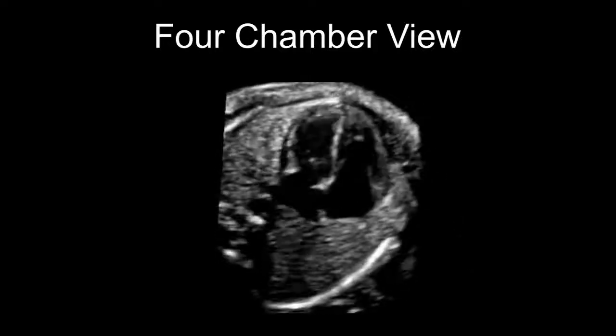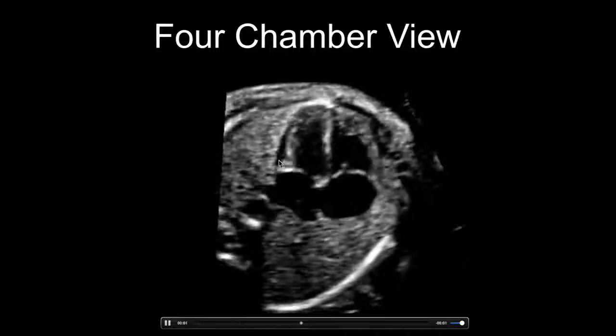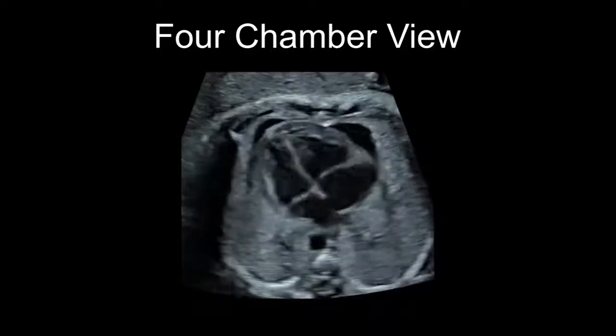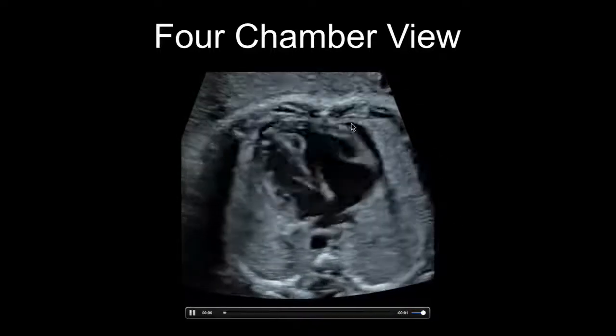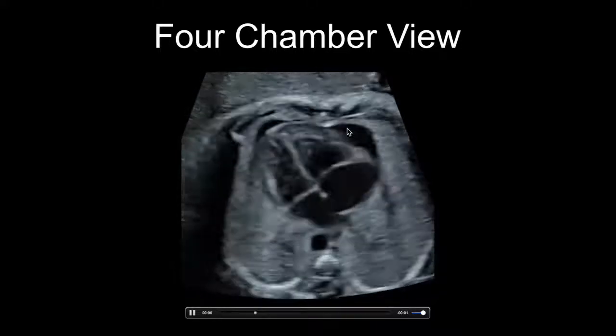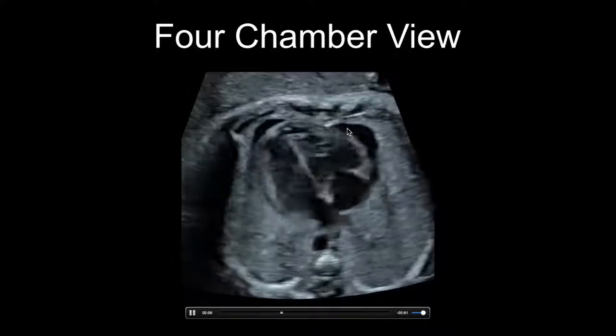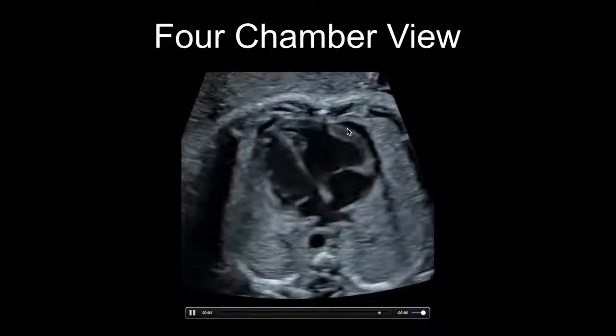So here's a normal 4-chamber view. There's always a little bit of pericardial fluid, as you see right here. And here's a little bit more than you want to see in this normal fetus, otherwise I saw this recently. And you measure, there are some 3-millimeter cutoffs and things like that. To me, it's more of a subjective assessment whether there's excess fluid or not.